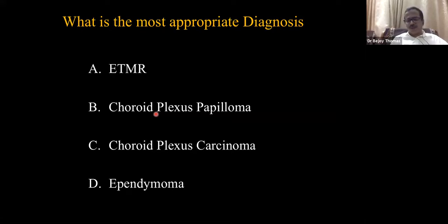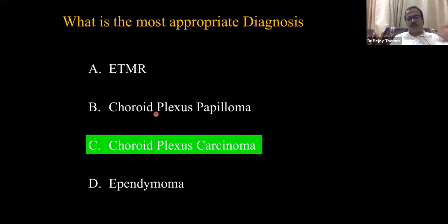It could probably be used only in serial follow-up in MR research of Alzheimer's disease, not really useful in clinical practice. So depending on the myoinositol, this is one area where spectroscopy is really useful, because other things all show very high perfusion and very bright diffusion, since the choroid plexus tumor is very vascular. It's not going to grade tumors.